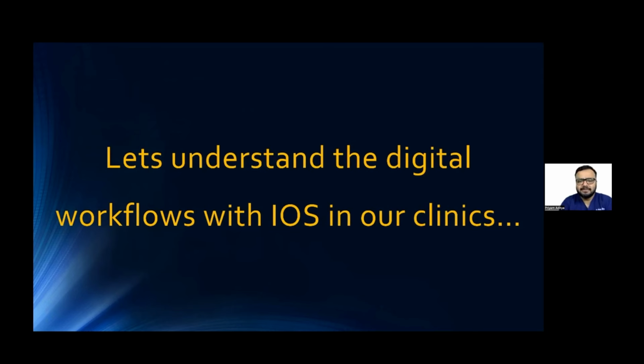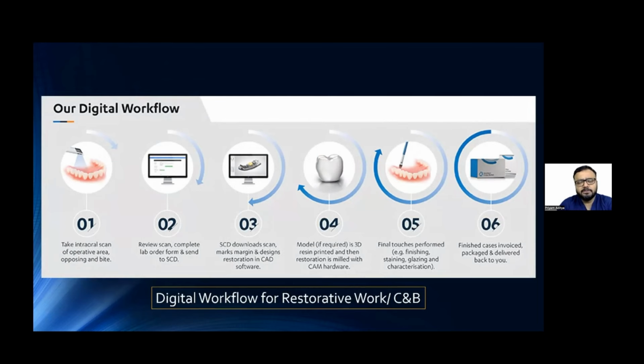So let's understand the basic workflow of a digital dentist in a clinic, especially when you are using intraoral scanners. What we do is we scan the jaw, we review the scan. Always review a scan. In fact, one tip from my side would be to always invert the scan. If you invert the scan and if you see any holes anywhere, you have to go and rescan that area. So then we review the scan data and we send it to the lab. The lab will fabricate a prosthesis depending upon what kind of work we have ordered. The prosthesis will be milled or printed and it will be finished and then it will come back to our practices. So this is a very basic workflow that will happen when you have an intraoral scanner.